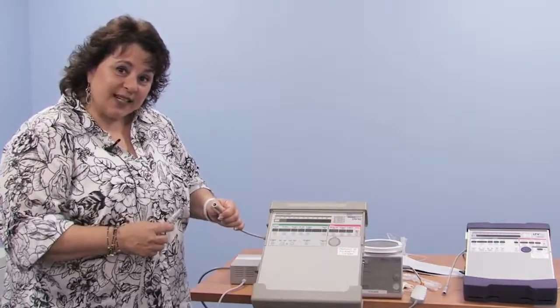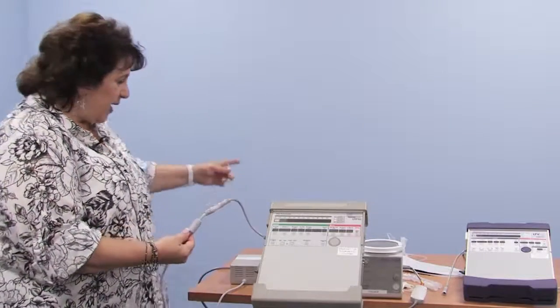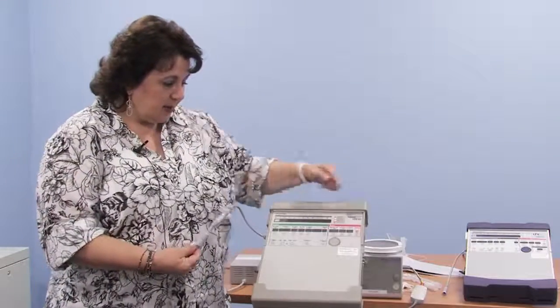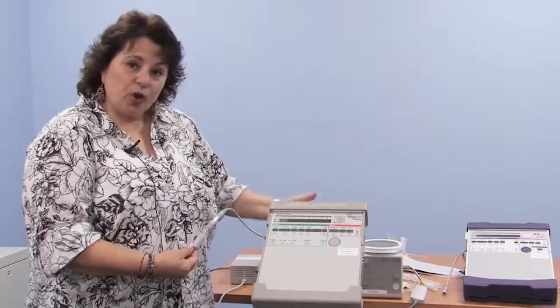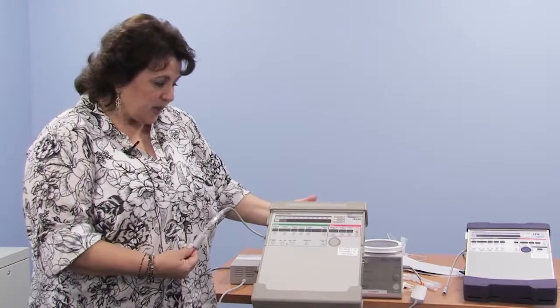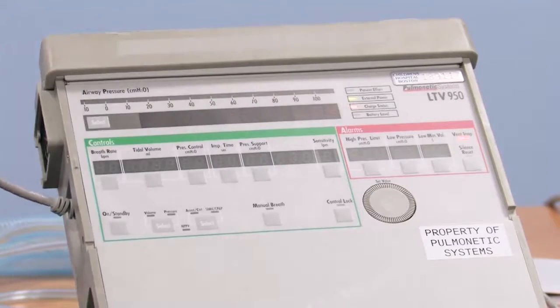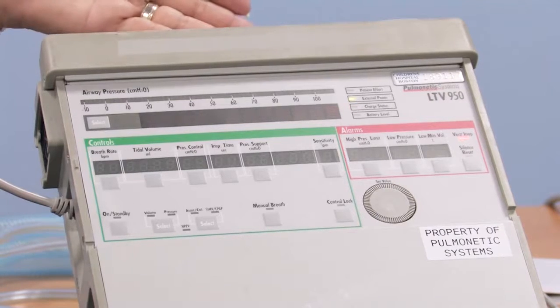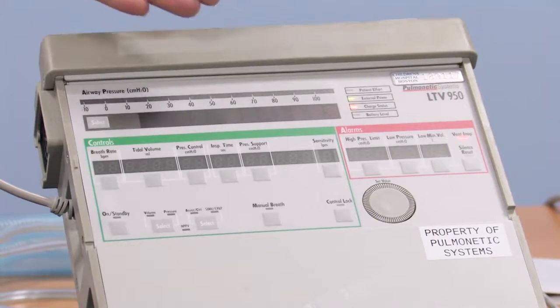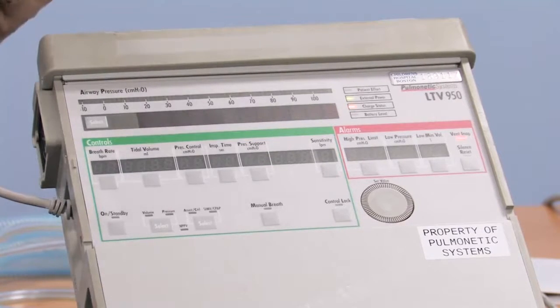When the LTV is connected to external power, like I'm going to do right now, we have it connected to the wall plug. What you see is the battery level light goes out because we're no longer using the 1 hour internal battery. We're now using an external power source. Unfortunately, the machine doesn't know what you connect it to. It doesn't know if it's on the 6-hour sprint pack. It doesn't know if it's on the wall plug of the hospital or your home or grandma's house. It does not know if it's on the overnight car battery.